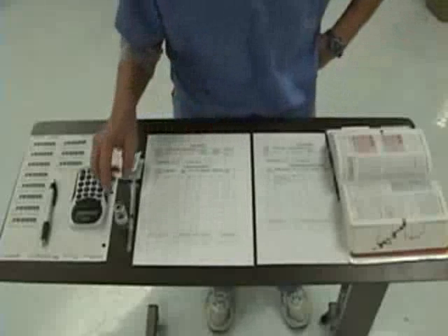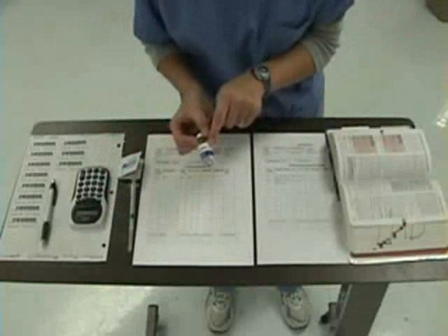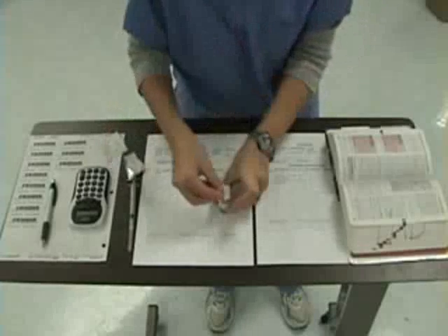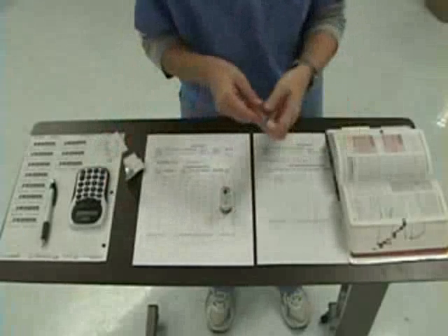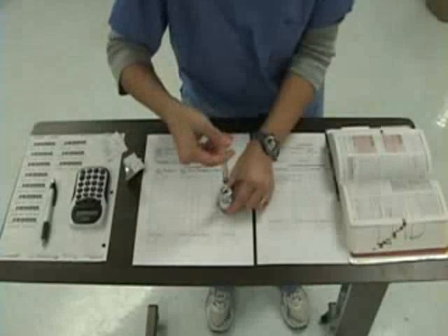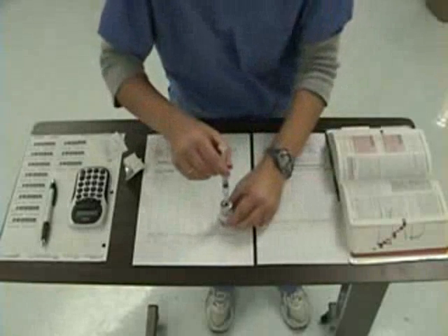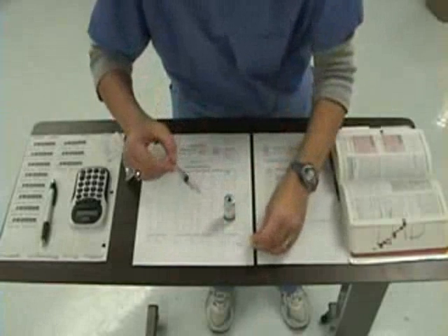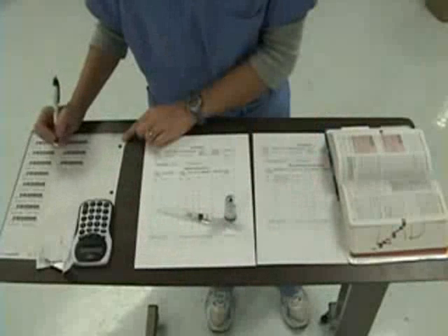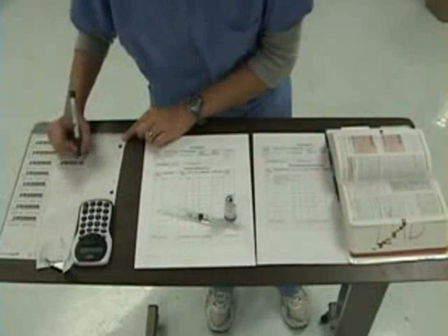My dose is 10 milligrams IV push. The concentration on my vial is Reglan 10 milligrams per ml. I will withdraw 1 ml of Reglan from my vial. On a patient label, I will write the drug, the route, and the dose.